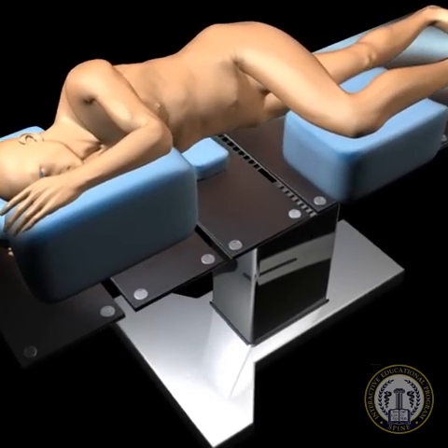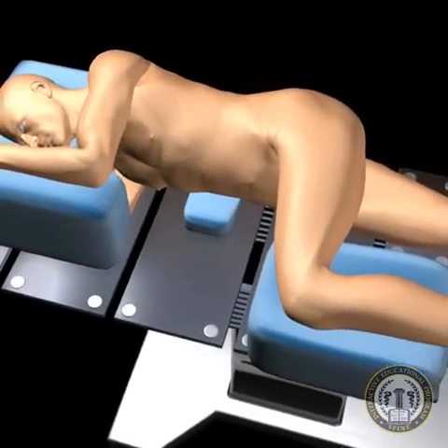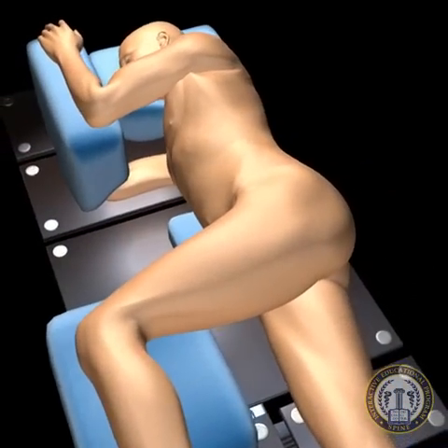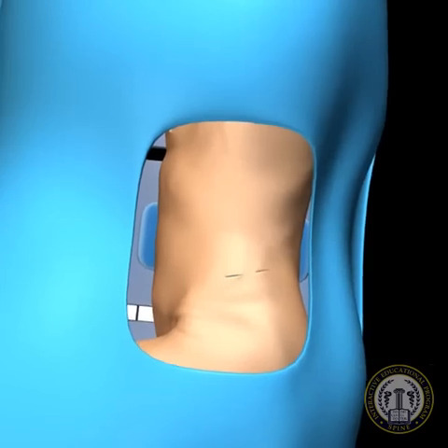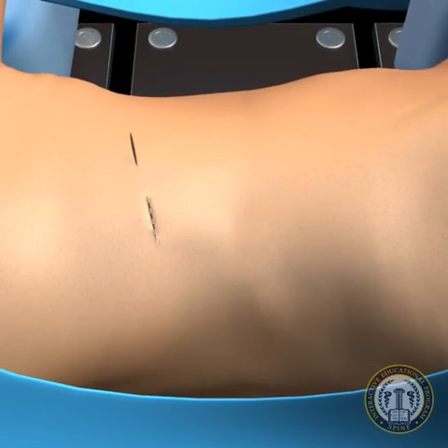The incisions for XLIF are marked prior to prep and draping by utilizing AP and lateral fluoroscopic imaging. The traditional incisions described by Pimenta utilize a direct lateral incision corresponding to the disc level to be approached. Based off this lateral incision, by a distance of approximately one finger length, a second incision is marked at the lateral edge of the lumbar posterior paraspinal muscles.